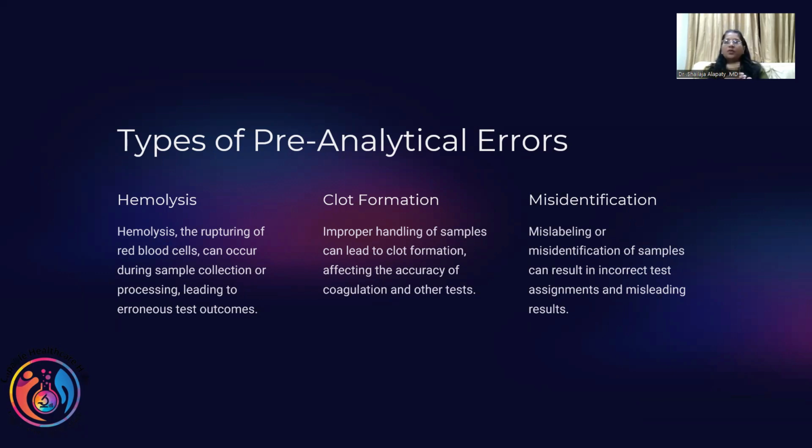So first and foremost, when the patient comes with the bill, we generate the label, stick it onto the vacutainer, and give that to the patient. And he goes there and they collect. We don't give the labels to the phlebotomist to stick on the tubes. At the registration counter, we stick the labels on the tube and give the tube to the patient, so that the patient has his own tubes with his own value. Got it? These are steps to mitigate errors.